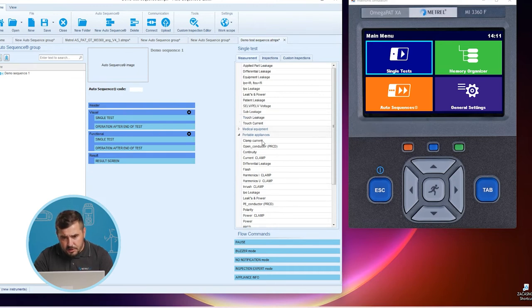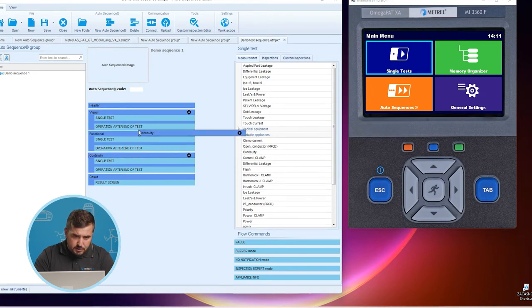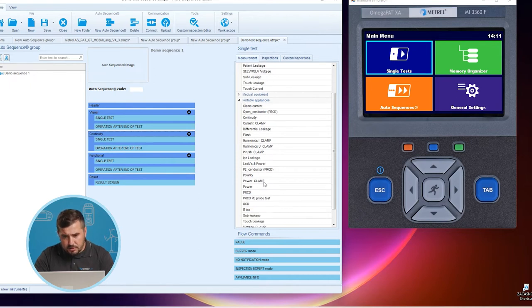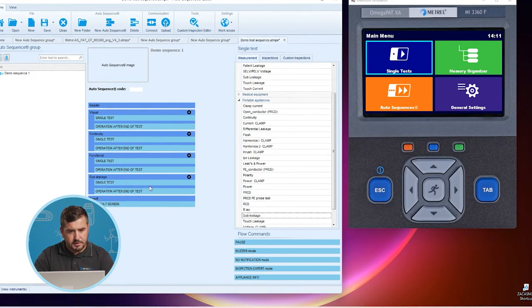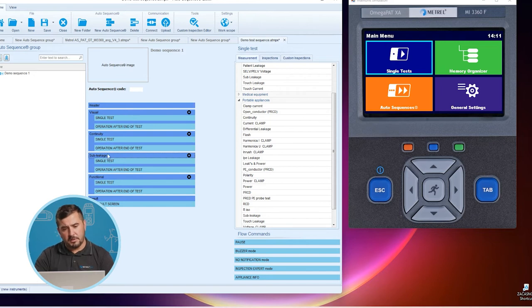So we have visual inspection, then we add a continuity measurement, and drag it into position. We also add a substitute leakage test and drag it one step higher. Now our sequence is organized: visual inspection, continuity test, substitute leakage test, and functional inspection.